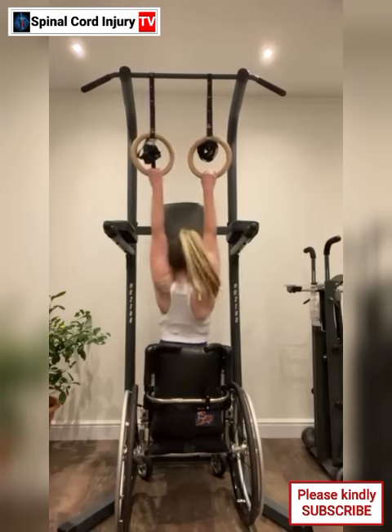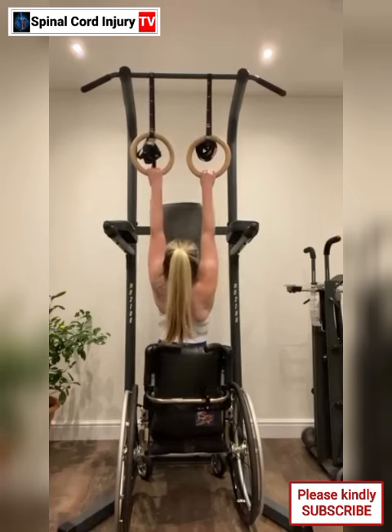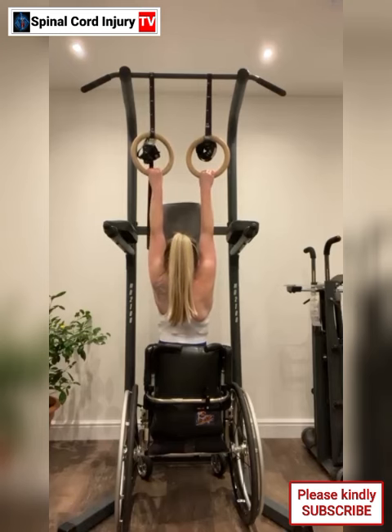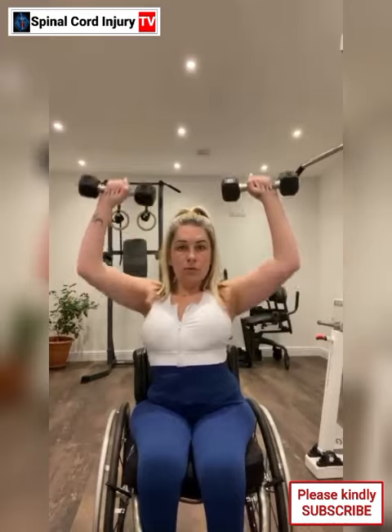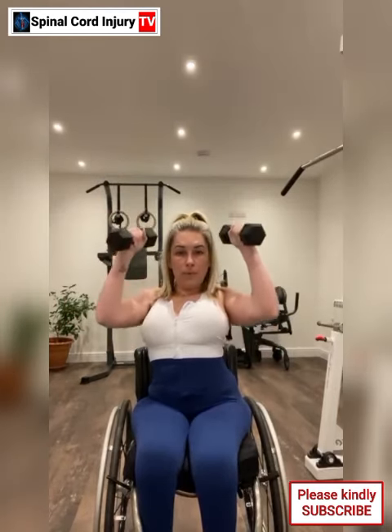Advantage 6: Improved circulation and range of motion. Regular exercise using an equalizer machine can contribute to improved circulation, flexibility, and range of motion, which are important for overall health and well-being. Advantage 7: Independence and empowerment. Being able to engage in structured exercise independently or with minimal assistance can boost confidence, promote a sense of independence, and contribute to a positive mindset.